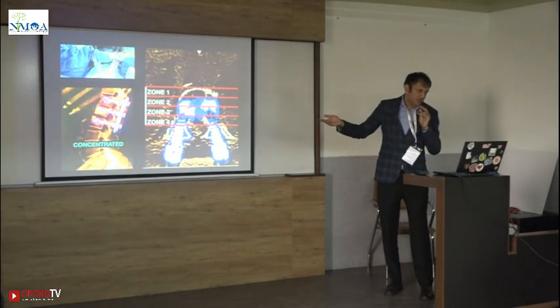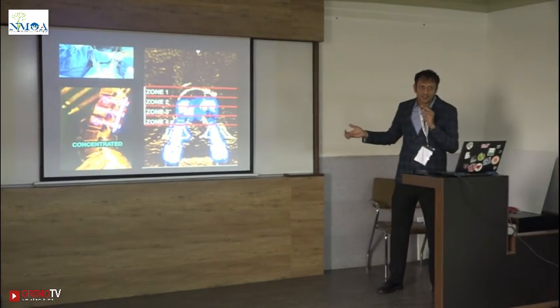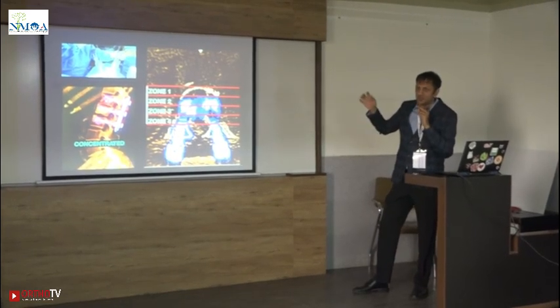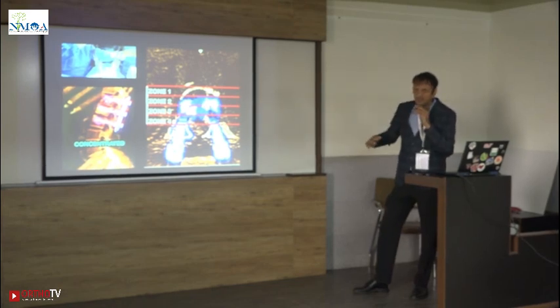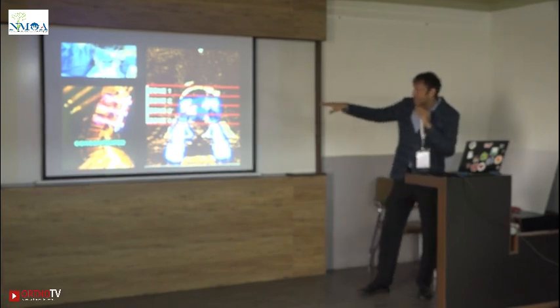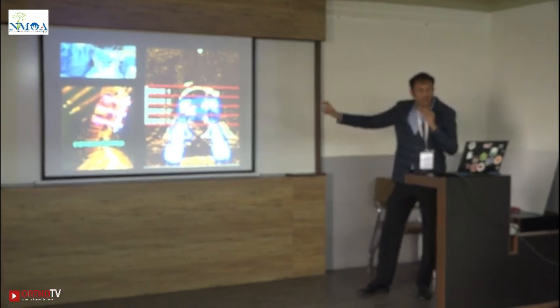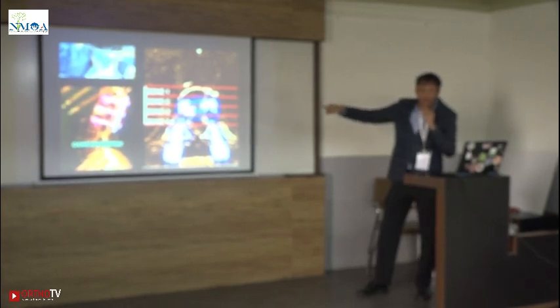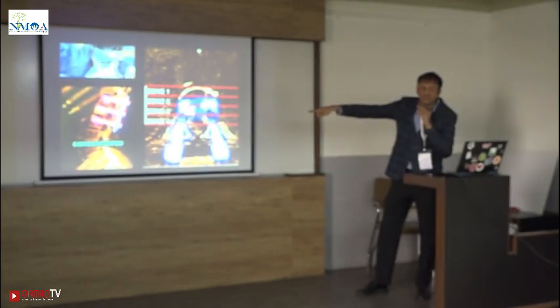This is very important because this is something which I had taken up as my research topic. We had studied some 400 percutaneous screws which were cement augmented, and what we did is we zoned them out in distribution. So when we do a CT scan, you can actually know where your cement is distributed in whatever zone.